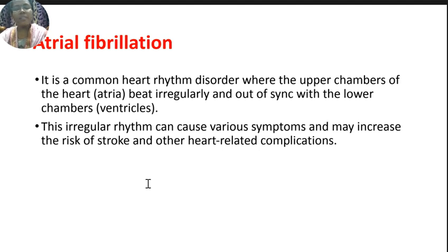Any changes in these features of the ECG are very helpful to diagnose disorders related to the heart system. ECG is a very preliminary diagnostic method used to diagnose disorders related to the heart. Any kind of heart disorder can be diagnosed and identified with the help of ECG. If we then have doubt, we can go for echocardiography, ultrasound imaging, or other imaging modalities such as CT, PET and SPECT.